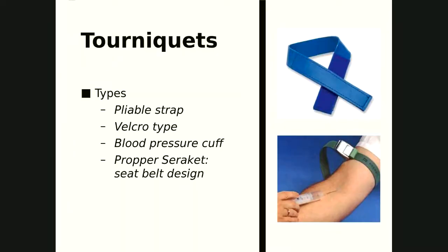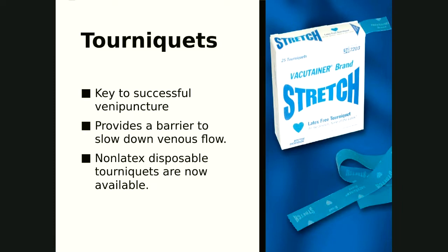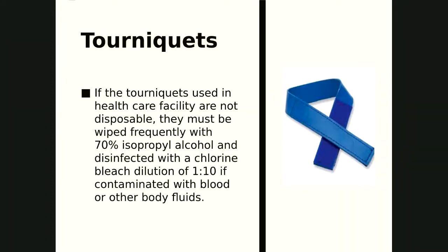There are different types of tourniquets: the pliable strap, the Velcro strap as shown here, the blood pressure cuff, or the seatbelt design. Key to a successful venipuncture is the use of a tourniquet. It provides a barrier to slow down venous flow, but we don't want it so tight that it cuts off arterial flow. Non-latex disposable tourniquets are now available. These are stretchy, which allows us to stretch to provide adequate tightness to visualize a vein. If the tourniquets used in healthcare facilities are not disposable, they must be wiped frequently with 70% isopropyl alcohol and disinfected with a 1 to 10 chlorine bleach solution if contaminated with blood or bodily fluids.